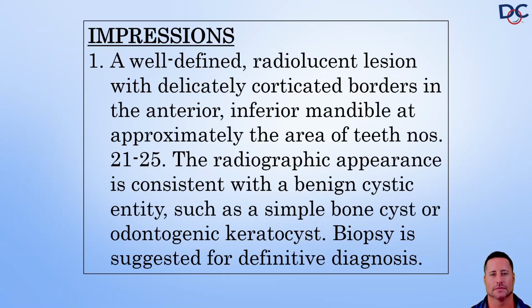So in my opinion, I don't feel and have never felt that I had any increased liability exposure by taking a 3D image on every single patient and not having it read by an OMFR. In fact, I felt the exact opposite, since I was able to help my patients so much more than I could have otherwise if I had only taken a 2D image, or two 2D images as the case may be.